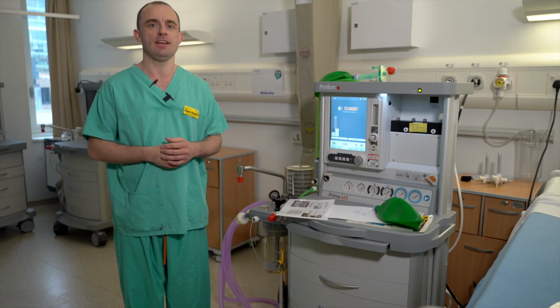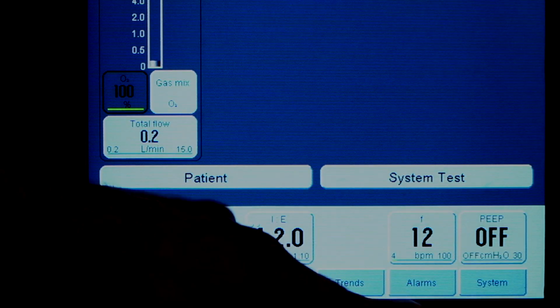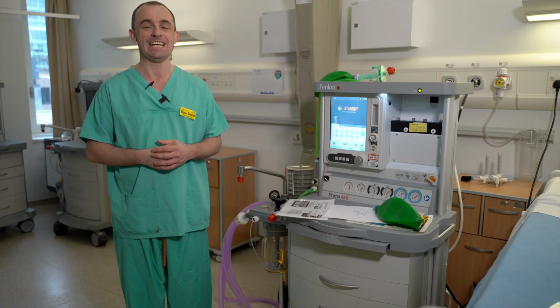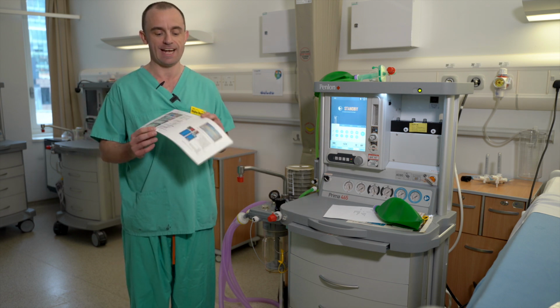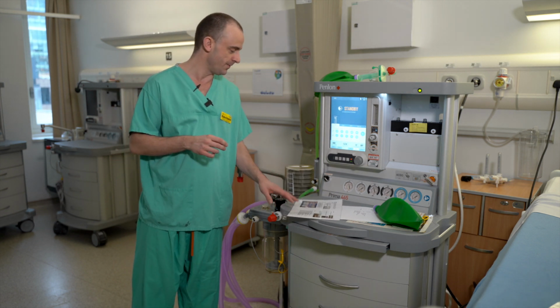The next step in setting the machine is to set the default alarms. Now, this is set here using the alarms tab. If you press it, you'll get the machine defaults, which are not suitable for use on intensive care and have to be set manually each time the machine is set up. The recommended defaults are attached to the reading and basic guide, which is next to the machine, but we'll go through each one of those steps.